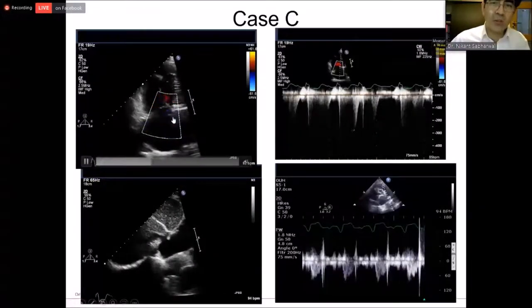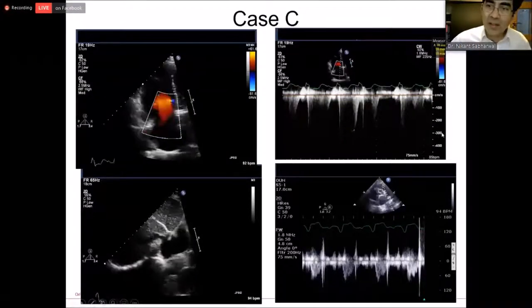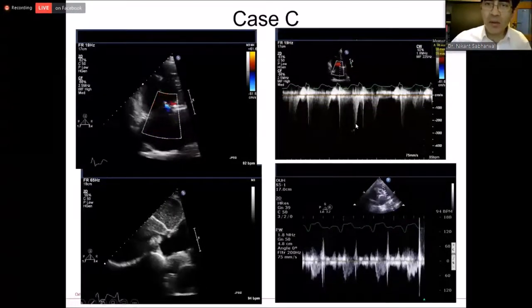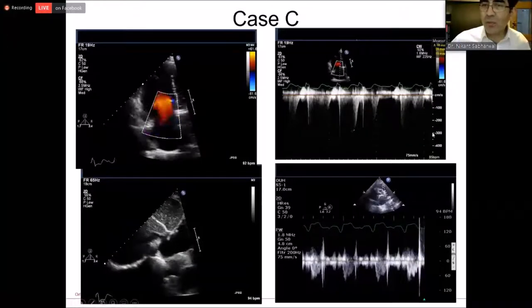Of course, there's tricuspid valve regurgitation. The TR velocity in this patient is more difficult. This is more of a real-world case. It's difficult to know exactly where it is. We could give saline to augment the Doppler flow, but in this case we were pretty happy to put it around here. It's in the intermediate range. It's more than 2.8, it's definitely less than 3.4.